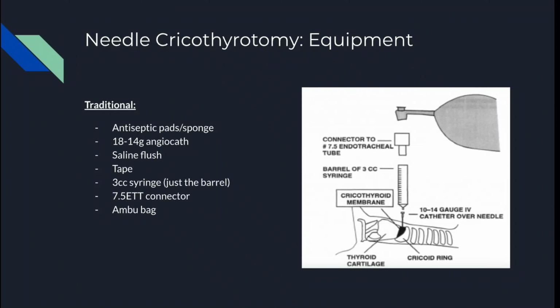So that longer length is also going to add to the resistance. So I don't know which would honestly be better, but there's going to be some trade-off between your 12 gauge decompression catheter versus your 14 gauge IV catheter. They're probably going to be pretty close to the same as far as resistance goes.